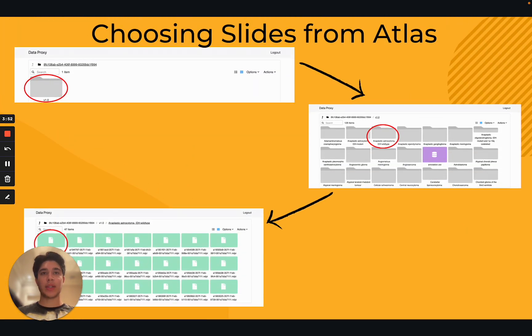After clicking this link, double click on the folder labeled V1.0 to view all of the folders in the atlas organized by tumor type alphabetically. Double click on the folder you are interested in downloading slides from, and you can choose to download any file by double clicking on it. For the purposes of this video, we will click on the folder labeled 'anaplastic astrocytoma.' If I double click on any one of these files, it will automatically be sent to the downloads folder on my computer, and I can then open it with a slide viewing software.